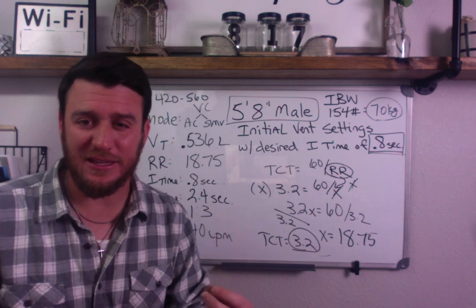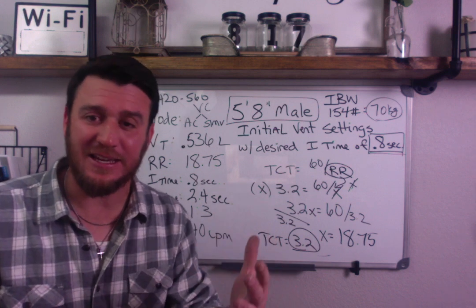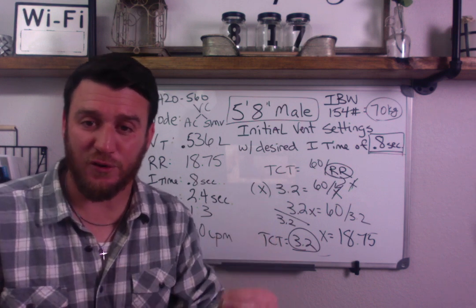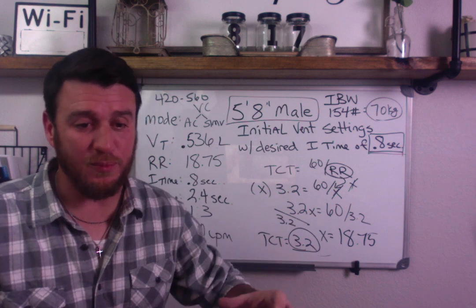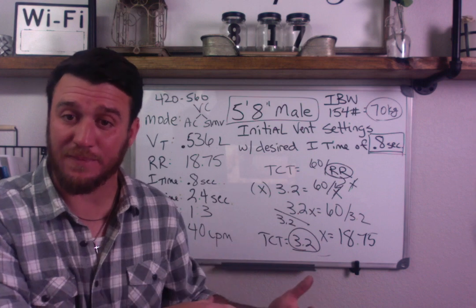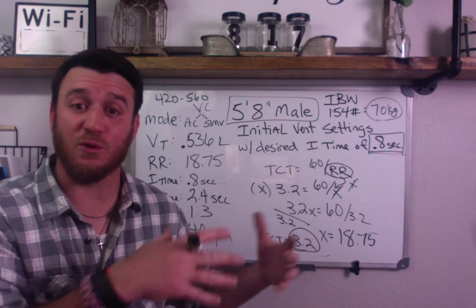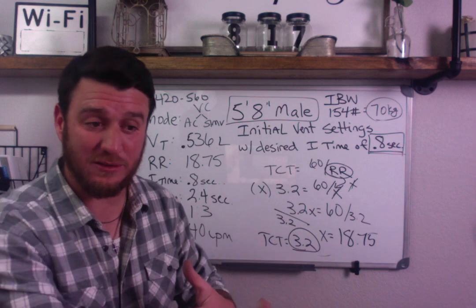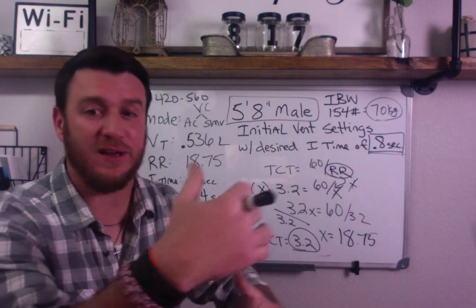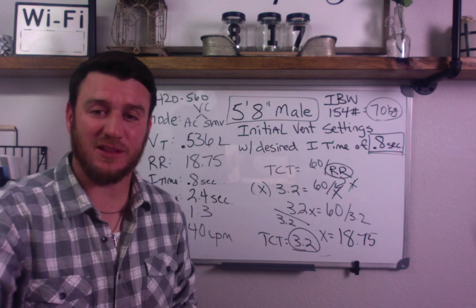I hope this makes sense. I hope you guys see this and go, oh my gosh, I see the way these formulas help us to come up with these values. And you understand how flow affects I time, how I time affects flow. You see how respiratory rate affects total cycle time, which affects E time, which affects I:E ratio. That's my goal here.